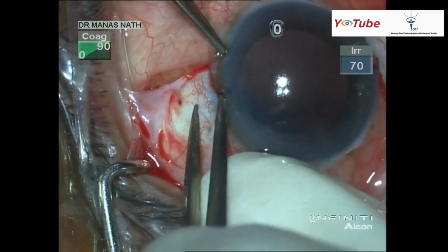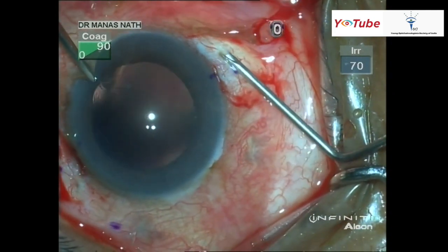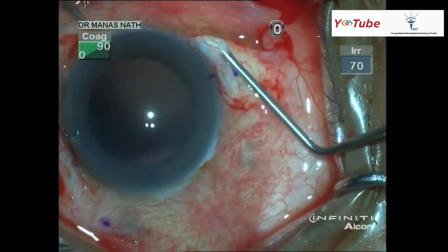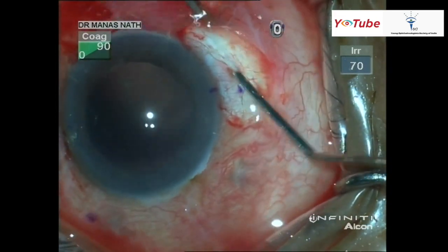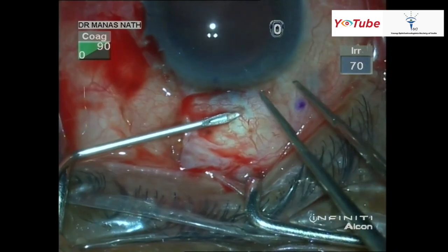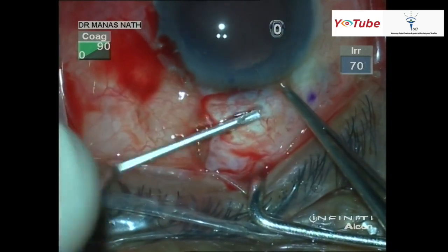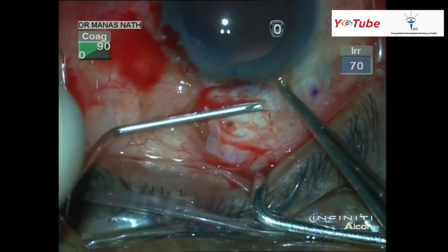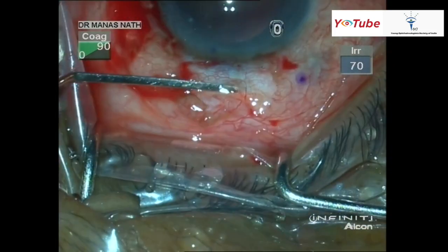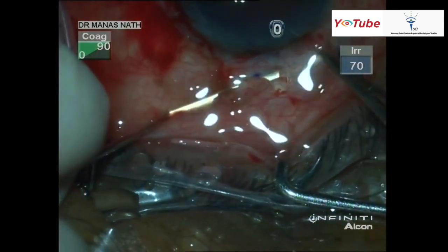I'm using a bent 23 gauge needle to make the straight scleral tunnel, which should be parallel to the limbus. It should be neither too thin nor too deep. This should be done on both sides for fixation of the haptics — sufficient length of the needle should go inside to have a good tuck of the haptic. Then I'm using a spatula to check the depth, verifying whether I am too superficial or too deep.